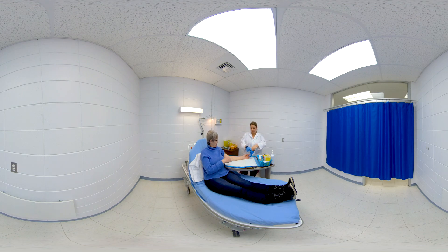She places the tourniquet at a distance of 10 centimeters from the chosen site and tightens it enough so that the veins become bulging. Placing the tourniquet too close to the vein to be punctured could cause it to burst. If the veins are not sufficiently visible or palpable, the following actions are indicated: have the patient close and clench the fist, lower the arm below the level of the heart, or place a warm compress on the site.